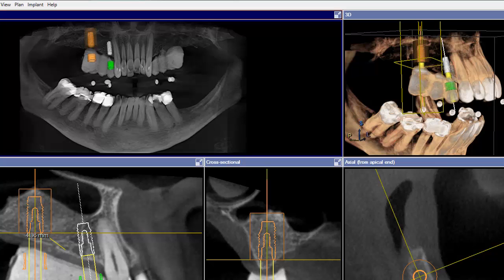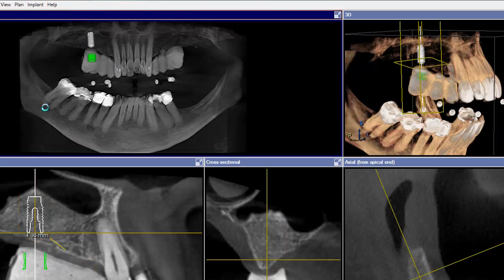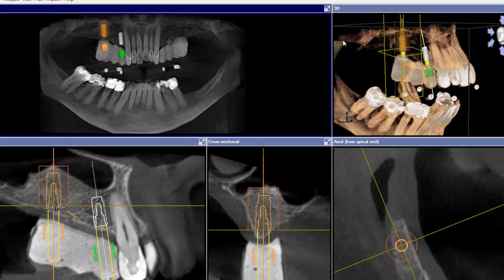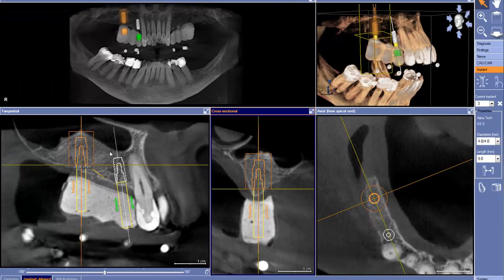So as I always do, I went ahead and duplicated the plan. As you can see, this is plan 5. So I'm going to dupe plan 5. So now we have the same plan, and we can take a look at it. So the first thing we're going to look at is we can see that either the dentist submitting the case or a surgical specialist has done a very, very nice bone graft. This looks to have been done, not looks, but it's very likely this has been done with a lateral window, Caldwell-Luc approach, to achieve the bone.